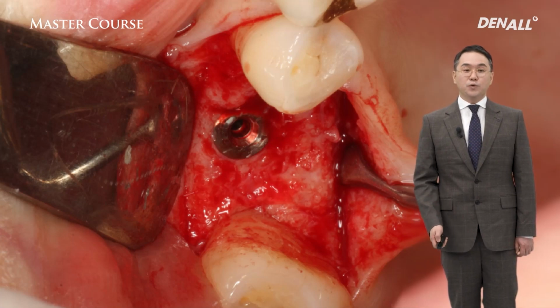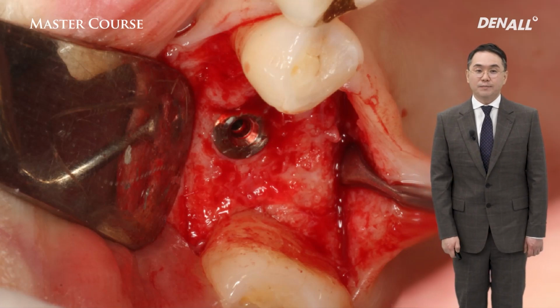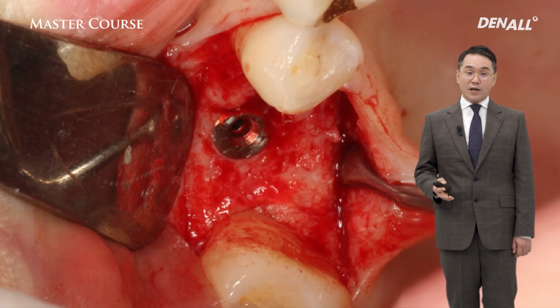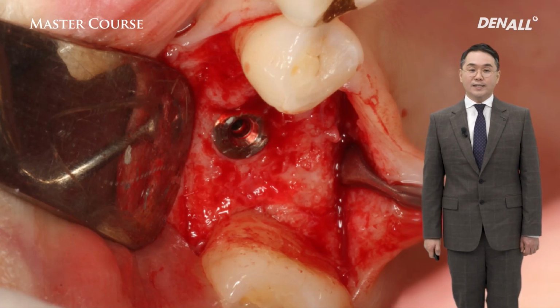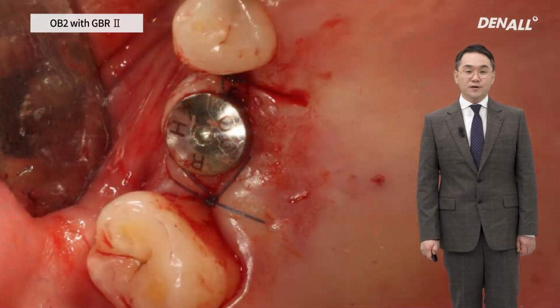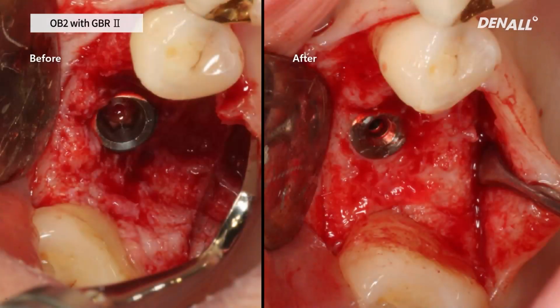You can see how the bone is regenerated. On the palatal side, sufficient thickness of bone has been regenerated. You can see that the bone has been regenerated in line with the Ossbuilder contour. 0.9 hex driver was used to remove the internal connection type anchor and healing abutment was connected, and that was how the surgery was completed.